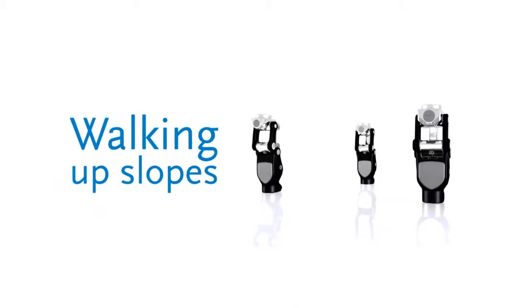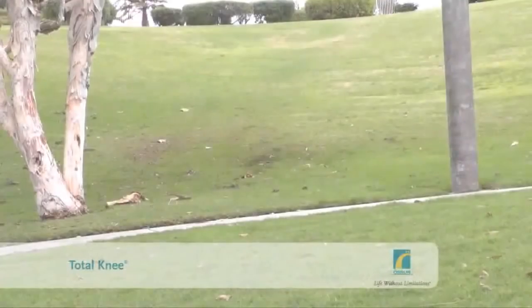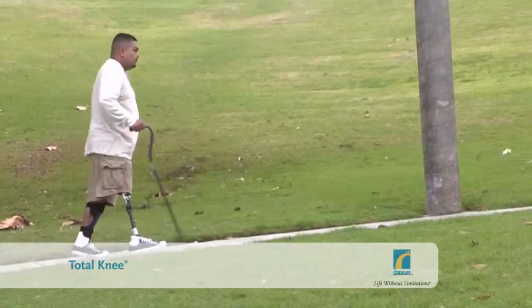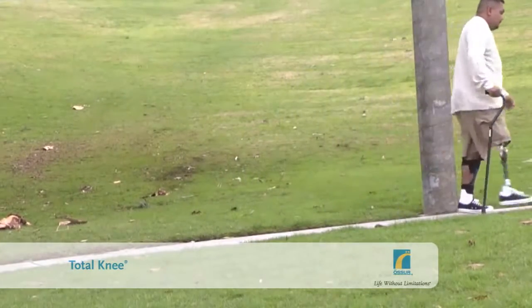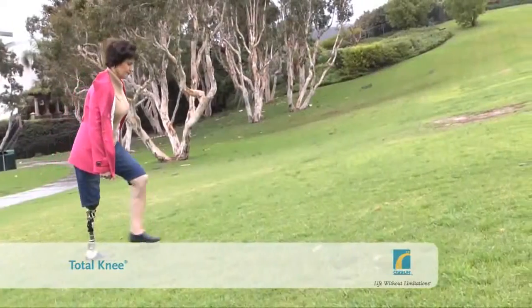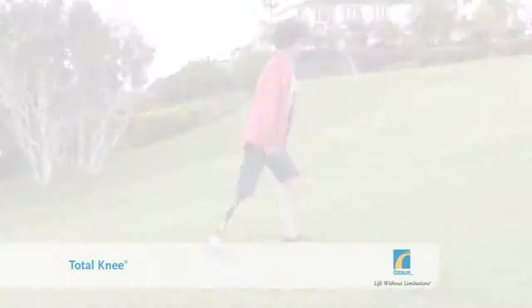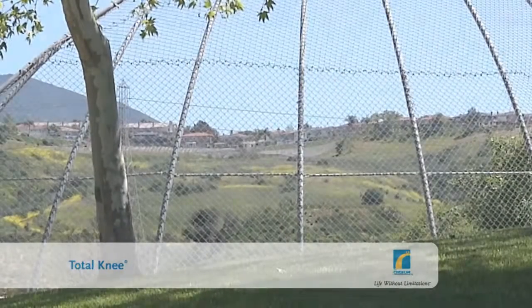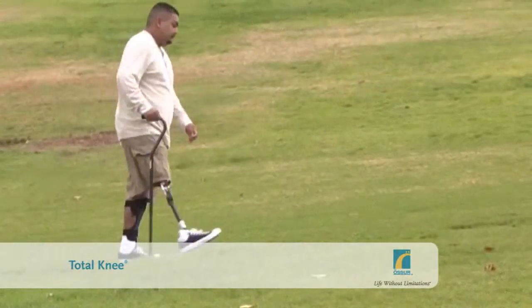Walking up slopes. Take the first step onto the slope with your prosthesis. Transfer your weight onto the heel of the prosthetic foot. Allow your body to progress steadily forward over the entire foot. As your weight approaches the ball of the prosthetic foot, the locking mechanism will release. Flex the thigh and swing the prosthesis forward.